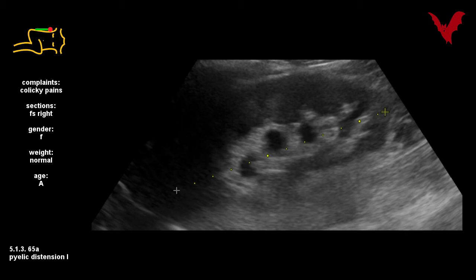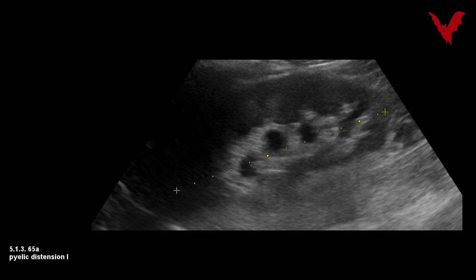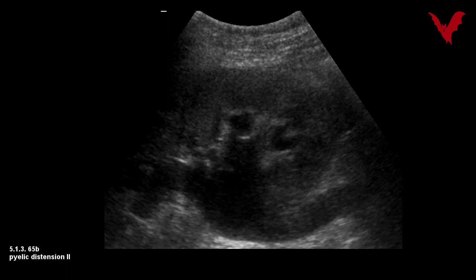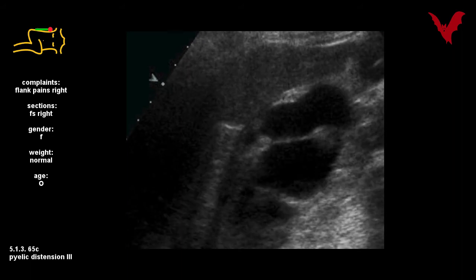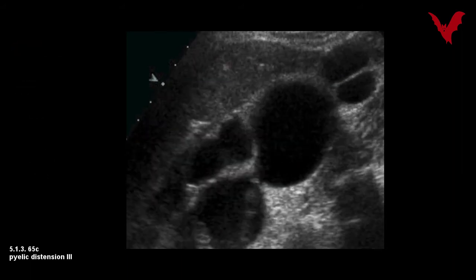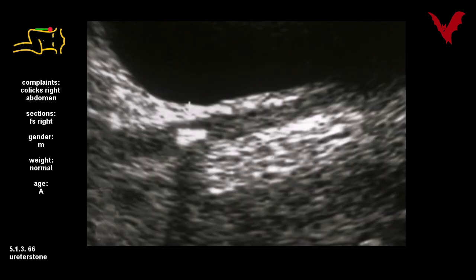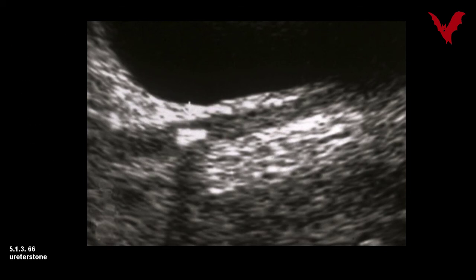This distension in 65a was due to a ureter concretion which resulted in this chronic distension, whereas in another case in 65b a metastatic prostate carcinoma caused urinary obstruction, and in 65c in yet another case it was a long-standing urinary obstruction leading to hydronephrosis. In case 66 careful echoscopic examination revealed the reason for the pains: a ureter stone.